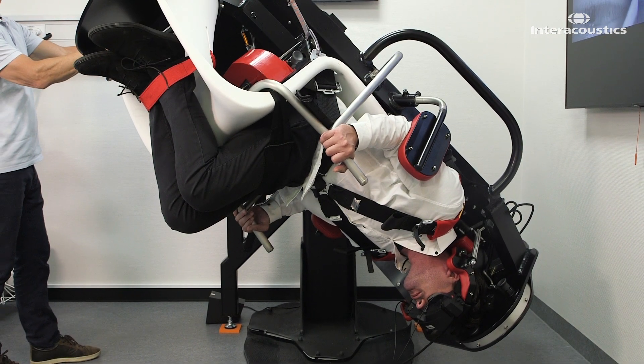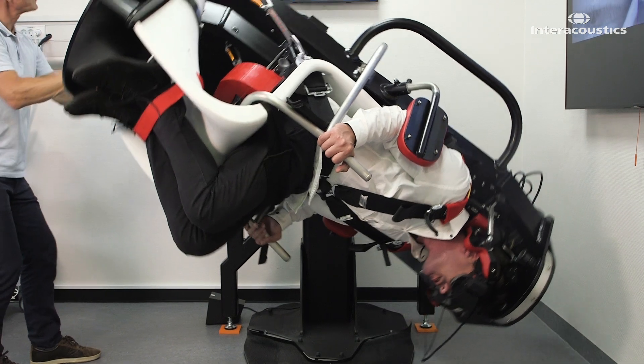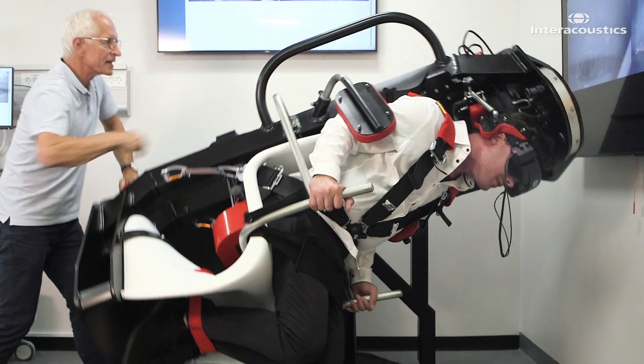Hold the patient in the final position for 30 seconds before returning the patient to the upright position.